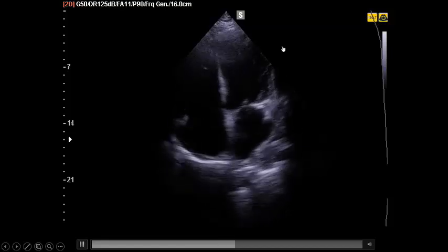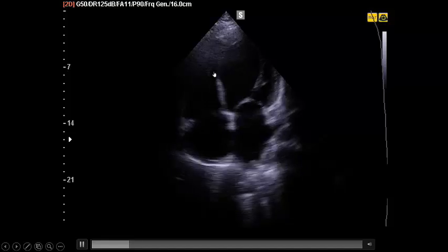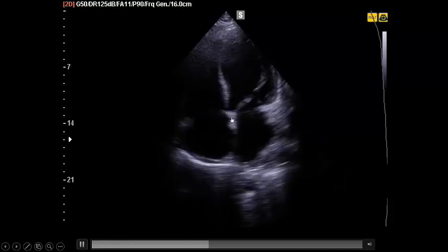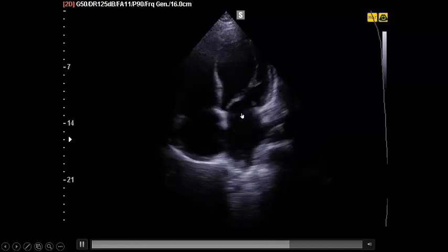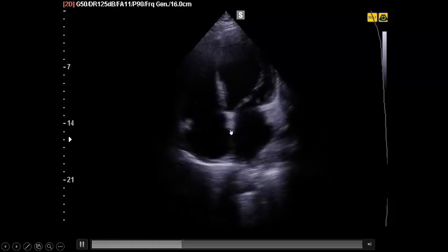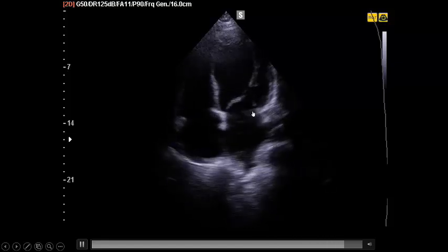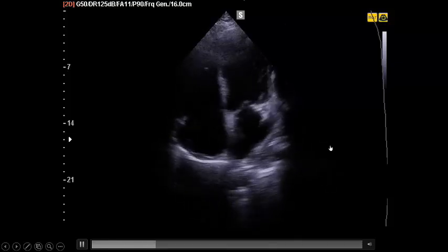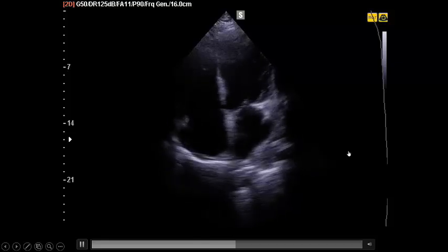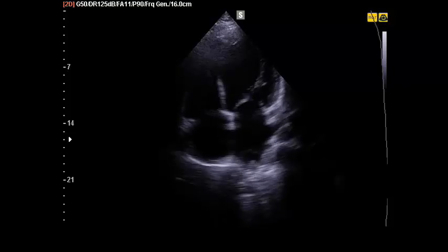In our patient, this is a 4-chamber view. There is generalized hypokinesia with dyskinetic septum, and as you see here by visual assessment, the anterior mitral valve leaflet is far away from the septum during diastole, with no proper thickening and dyskinesia. This denotes severe left ventricular dysfunction by visual assessment.